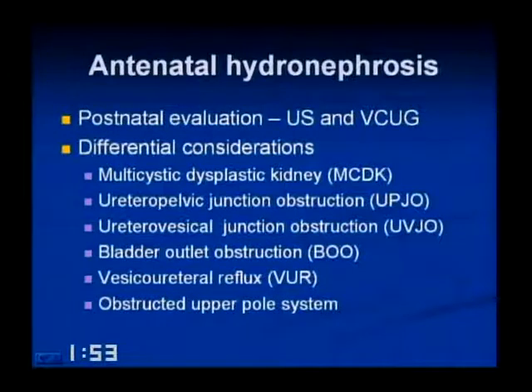GFR increases with age, so if the examination is normal in the first several days of life, you may want to bring the patient back at about 6 weeks of age and do another sonogram. So routinely we do ultrasonography and voiding cystourethrography in these patients.